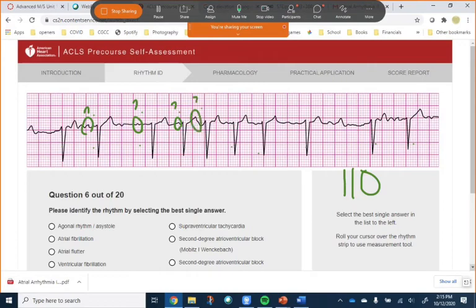Are we making cases for things? Are they even? I'm not going to make a case for these. None of these look the same. The only one that I think looks like a P wave is that one, and maybe that one. Maybe that one. But the difference is that there's nothing consistent here. Okay? I'm not sure. None of those look the same. It is an irregular rhythm with a normal QRS.